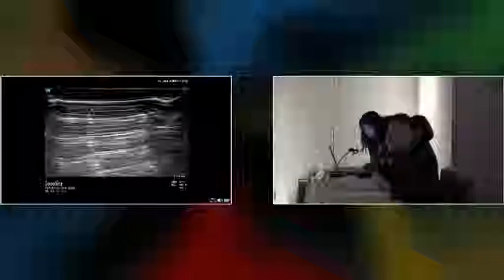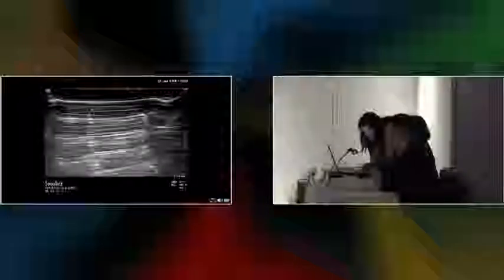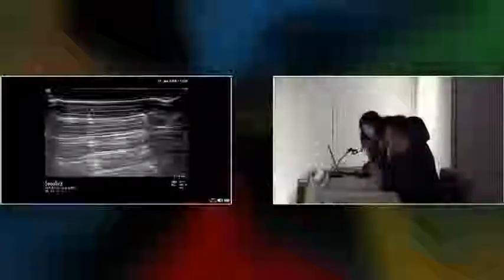It's just head-to-toe scanning. I know that I'm a little bit too greedy to put a lot of scans in 1 hour. We plan for 7 scans, a brief review, and the scan. But if we cannot make it from head to toe, we probably can stop at head to butt. That is fine.